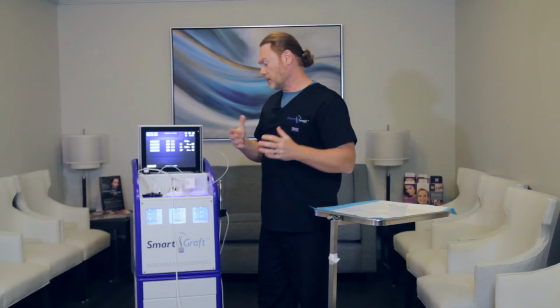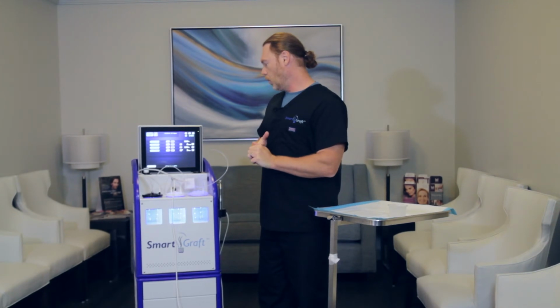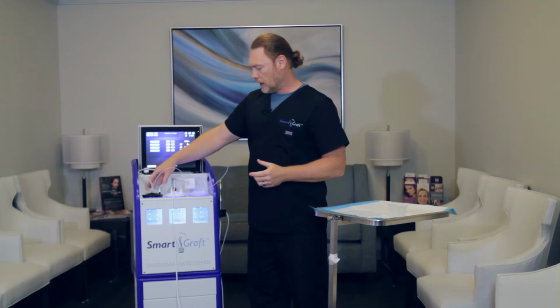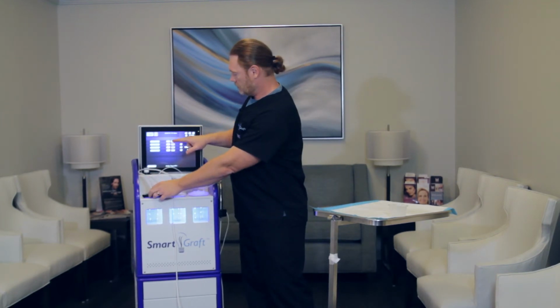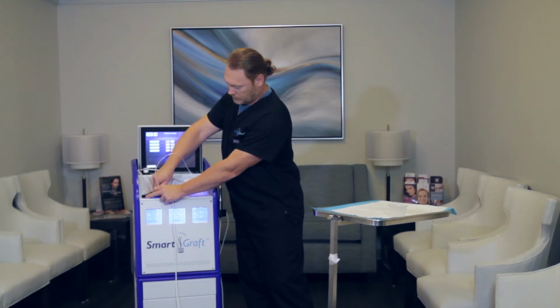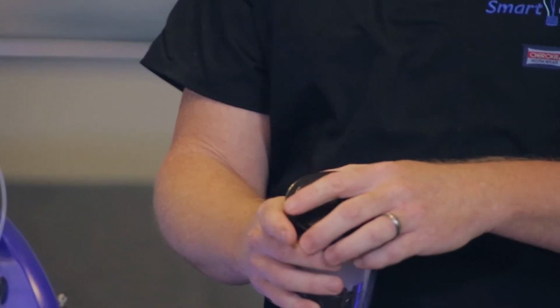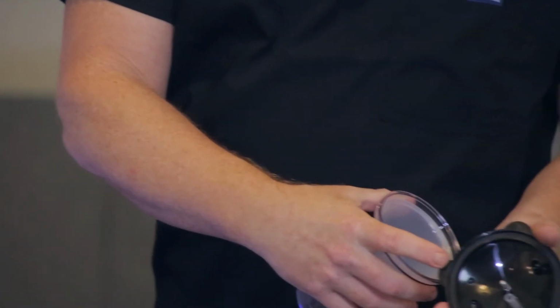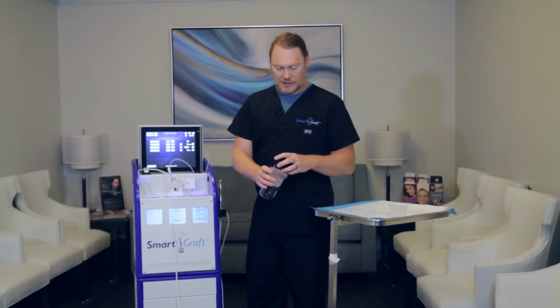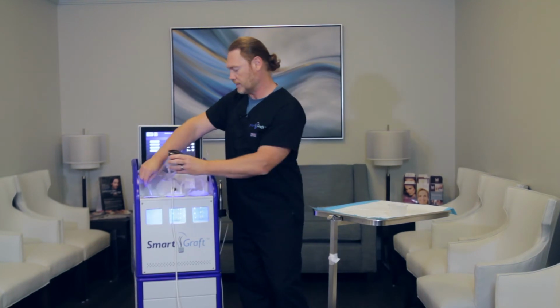As far as troubleshooting, there really isn't anything to troubleshoot. There is a few things. One is that if you were to hear a squealing of the device at all, it would be one of these, which I'll show you, one of these gaskets on the lids. Each lid has a rubber gasket inside the lid. You just need to make sure that it's laying flat and snug, and that will take away that issue if it does squeal. It doesn't happen often, but it can.